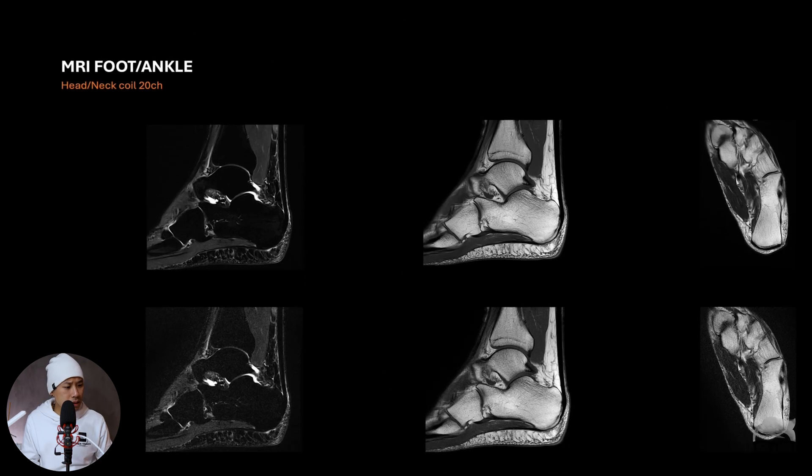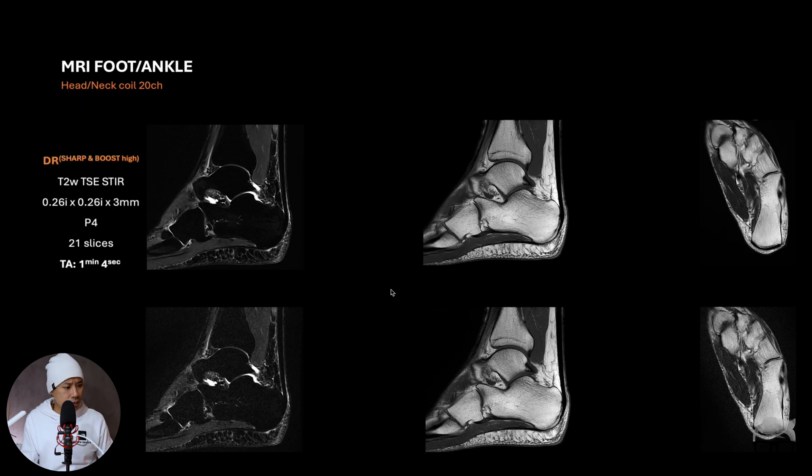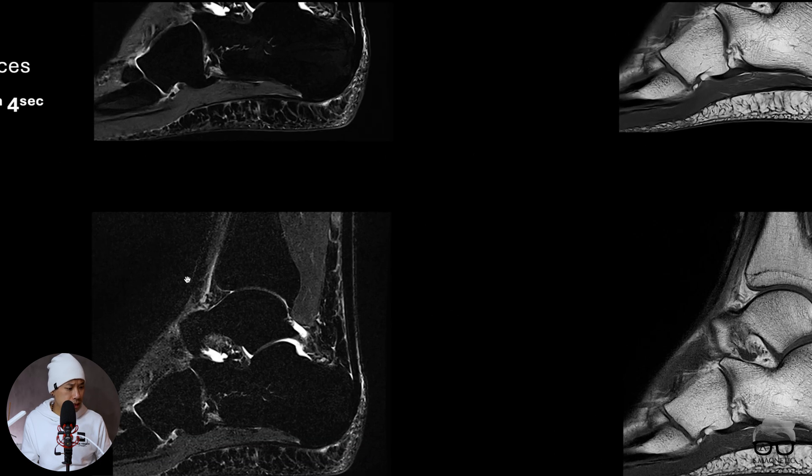Further on I did the whole protocol and it was very fast. This is the STIR sequence — same approach: high resolution, PAT 4, 21 slices covering the whole ankle. This one took around one minute. Turning it off, you can see there's some noise, as you can see here.